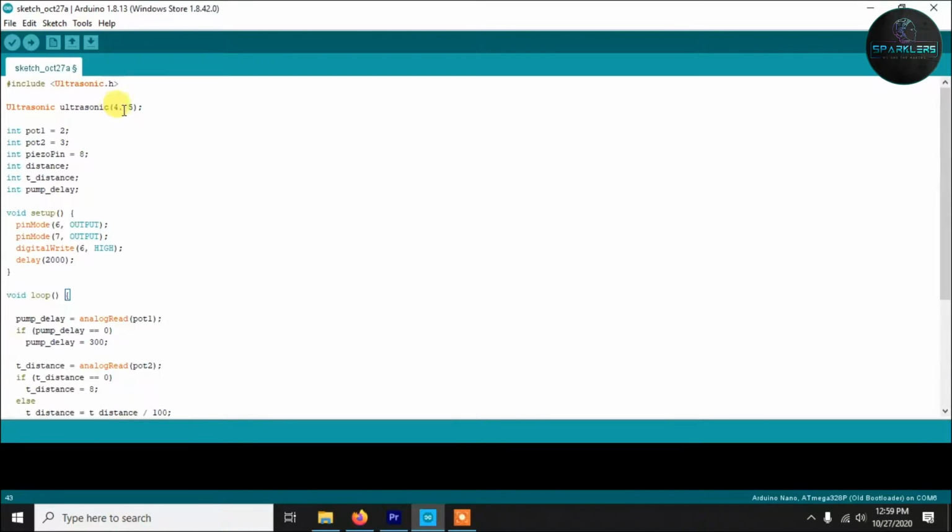So here is the 4 and 5. Now here 4 and 5 is the pin number. Like I said, I am using digital pin number 4 as the trigger pin, and digital pin number 5 as the echo pin. That's why I have written here 4, 5. Okay, and the sequence is very important here. At first there will be the trigger pin, then the echo pin.